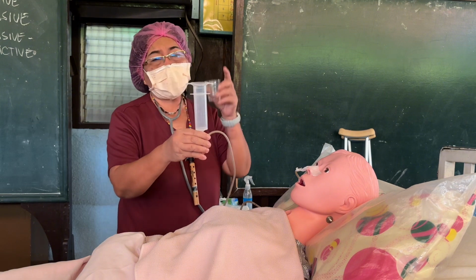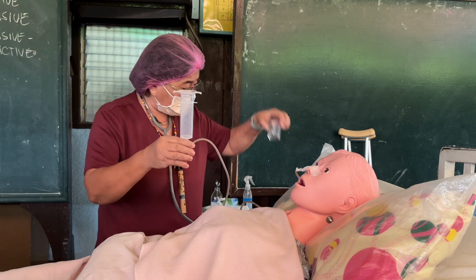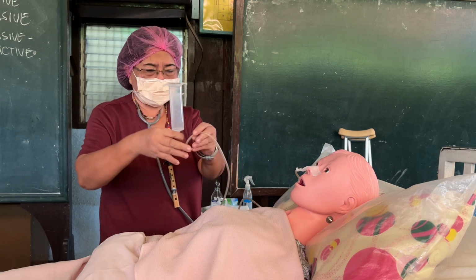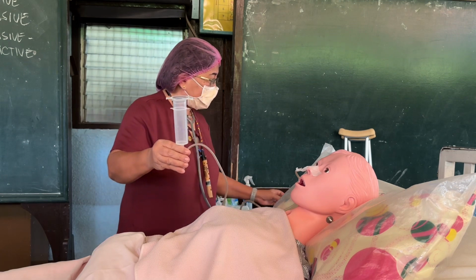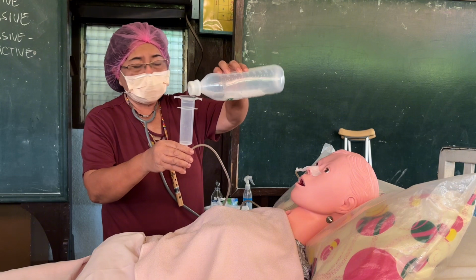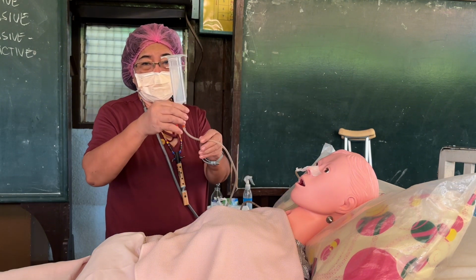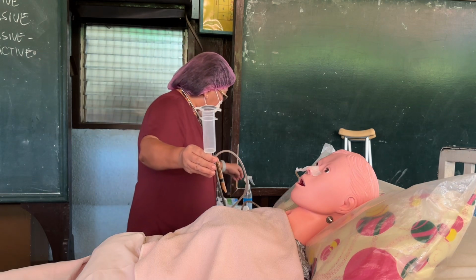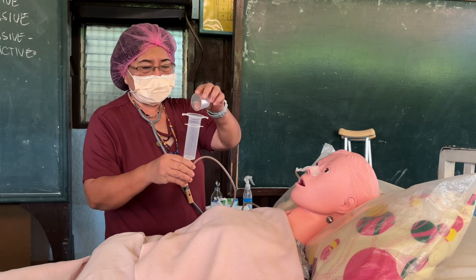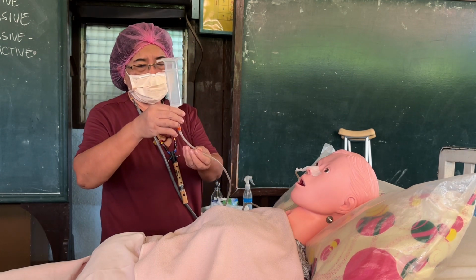Now, I'm going to pour the amoxicillin first. So, capsulated, dissolved in 10 ml water. Okay? Drain. Another 10 ml of mineral water, class, after amoxicillin. Okay? Then another 10 ml of Tempra. Then you drain.